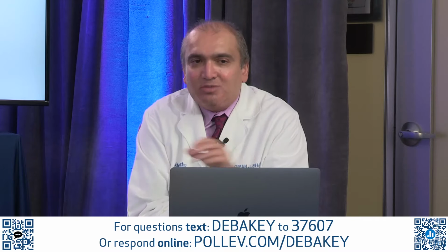So when we were initially doing the studies for pacemaker and device safety, we didn't want to see a change in thresholds that was actually just due to the natural change. That 6-week recommendation has actually been softened now in clinical practice. And so for valves, you don't need to wait 6 weeks either. Yep. Wonderful. I think you can do it a few days after.